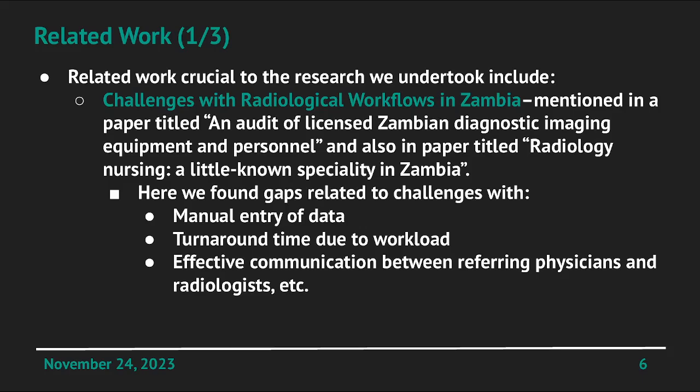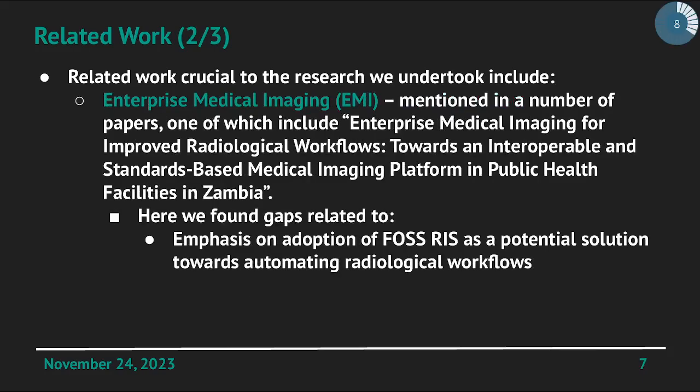Work crucial to the research we undertook includes challenges with radiological workflows in Zambia, mentioned in a paper titled An Audit of Licensed Diagnostic Imaging Equipment and Personnel, and also in a paper titled Radiology Nursing, a little known specialty in Zambia. Here we found gaps related to manual entry of data, turnaround time due to workload, and effective communication between referring physicians and radiologists.